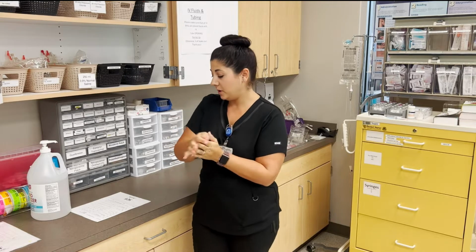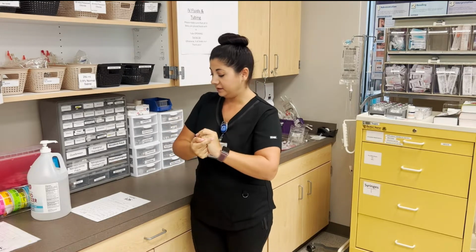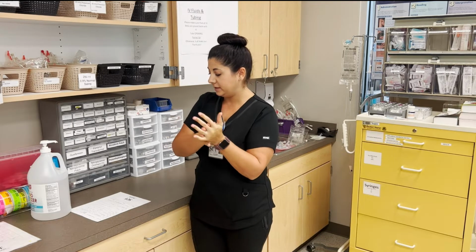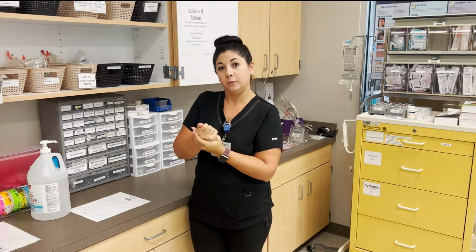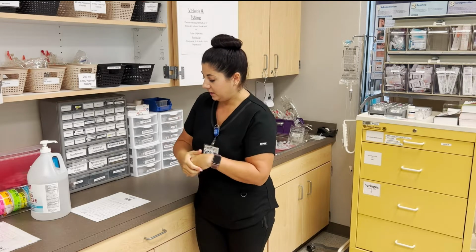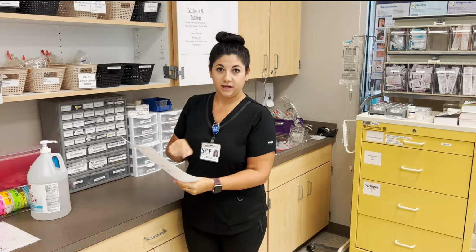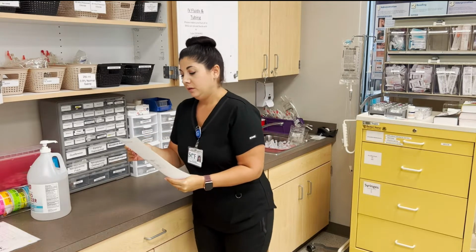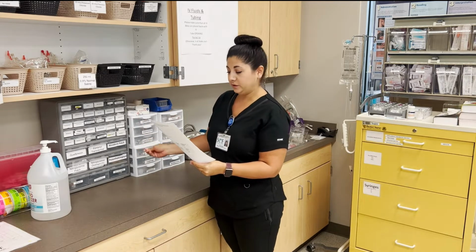And then look at my MAR, making sure that I have the correct patient. Their name and their date of birth are on there and are correct. I'm looking at their allergies to ensure that I'm not giving anything that they might be allergic to. I am looking at the time and determining which of these medications I need to give. Then I will pull the medications from our automated dispenser.